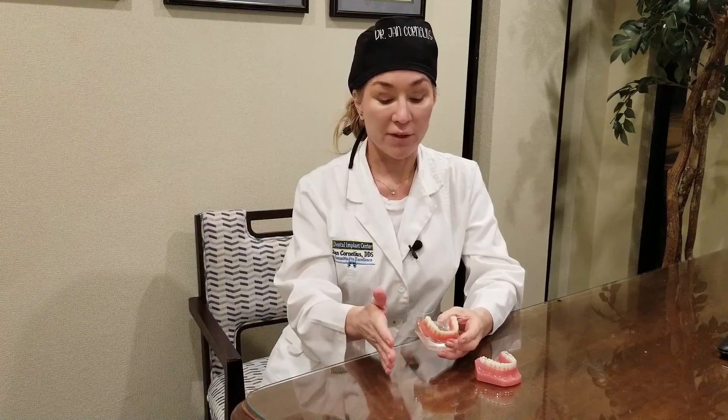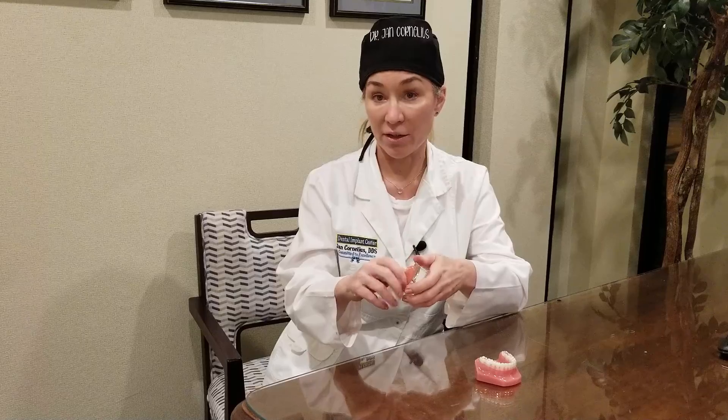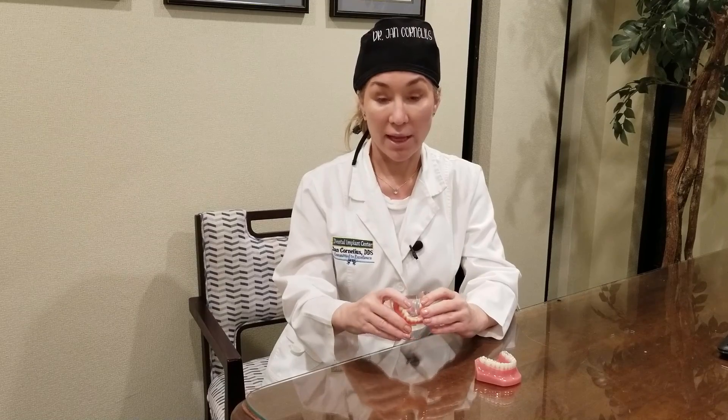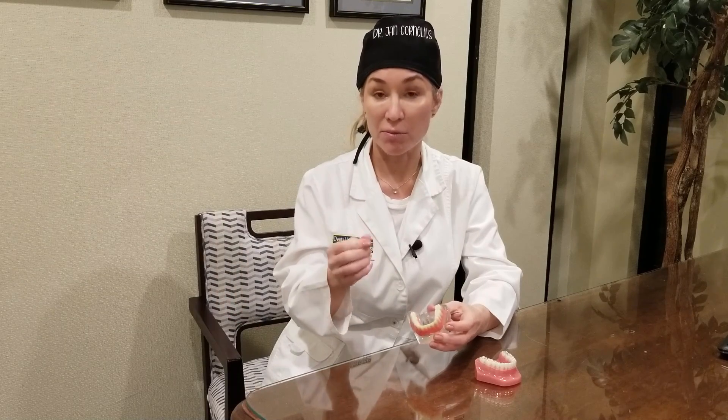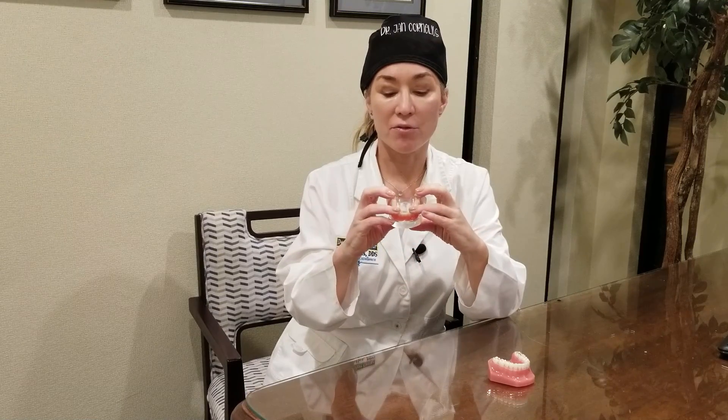As we mentioned in an earlier YouTube video, you can work your way up. The snap option is very good and a lot of people just stop there. Or there's something a little better — fixed in plastic. Then there's the fixed, screw-retained option that is just like teeth; you can floss underneath it, it stays in all the time. If you're not liking the tad bit of movement with the snap, a screw-retained or cement-retained fixed option is the solution.